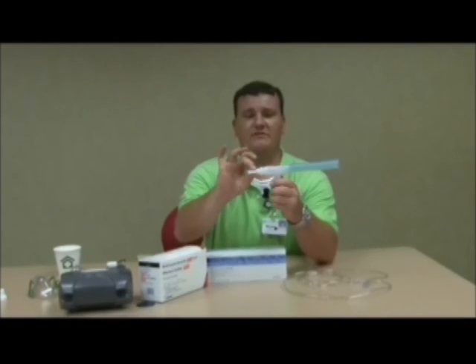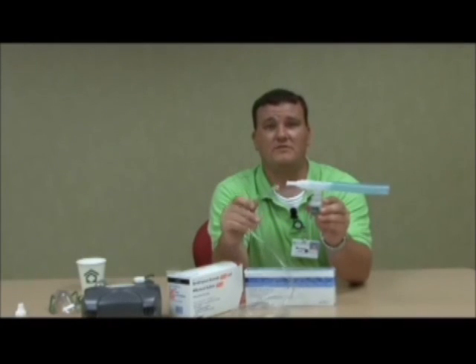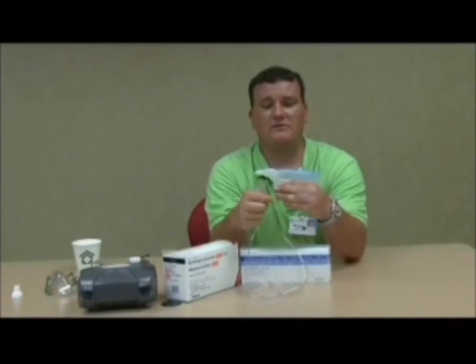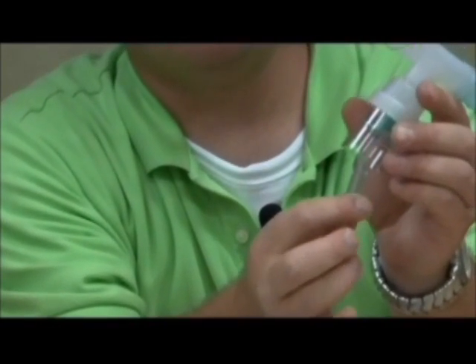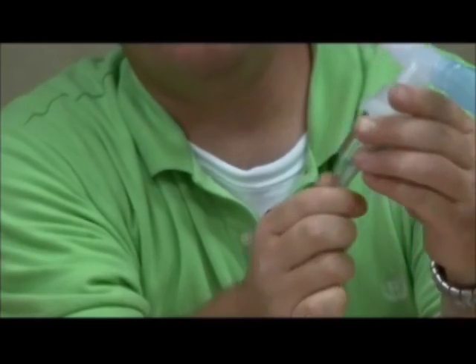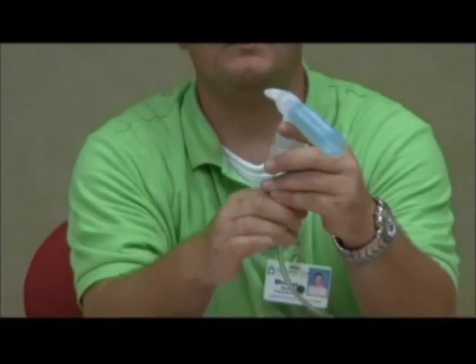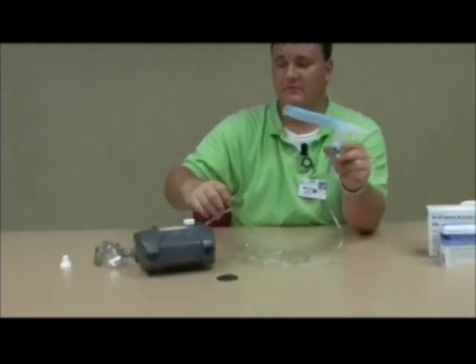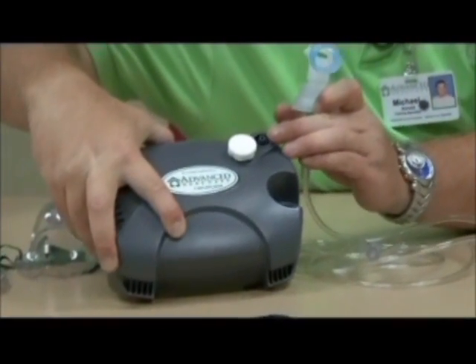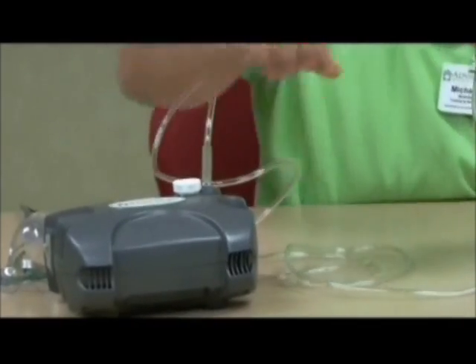Once you have your corrugated tubing on correctly, you will then need to get your mouthpiece. Insert your mouthpiece on the opposite end of where the corrugated tubing is. Next, you will need your nebulizer kit tubing. They both have the same ends, so it doesn't matter which end you use first. Connect it to the bottom side of your nebulizer kit. I recommend giving it a little twist as you push down to get it snug, because sometimes a compressor will blow it off. Once attached, connect the other end to the nipple adapter on your nebulizer. Twist and push down to get a snug fit.